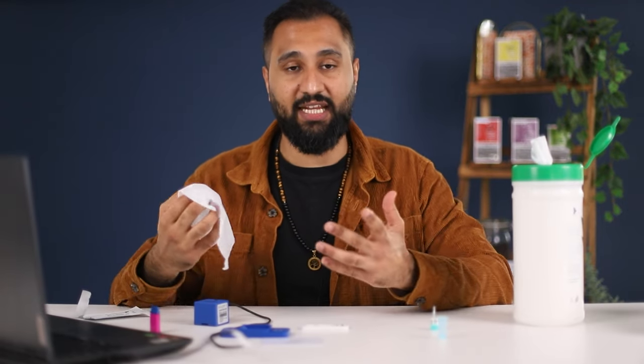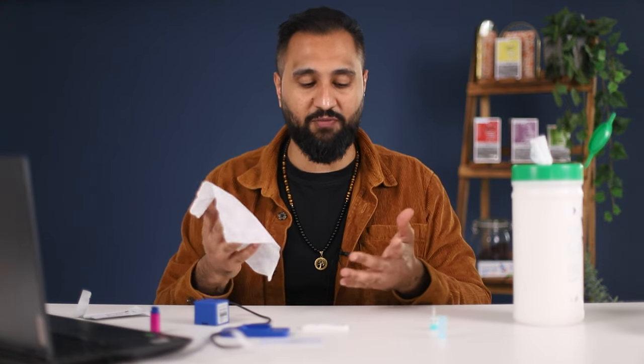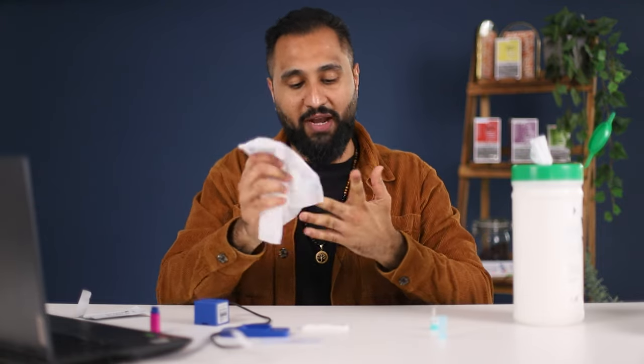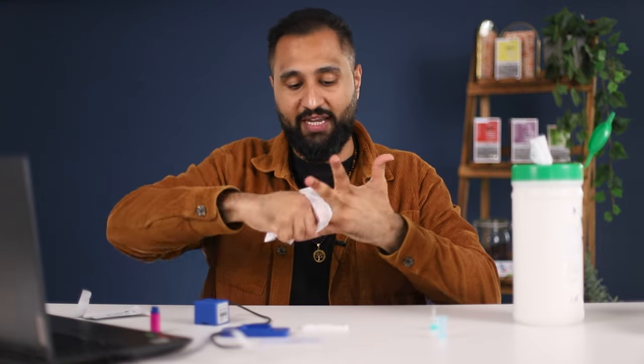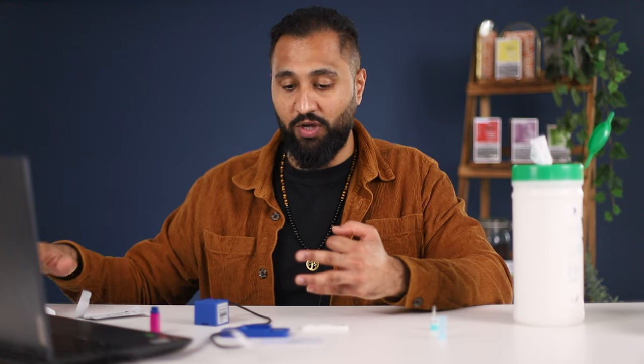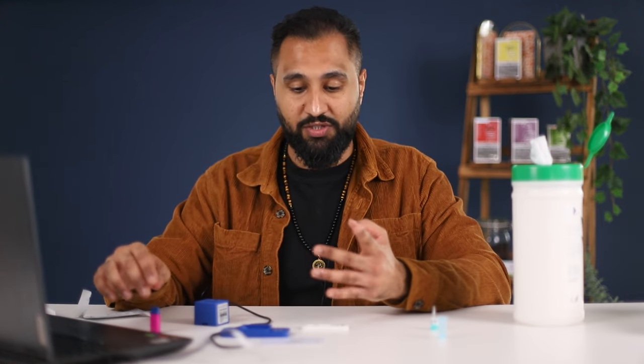The next step is to clean the hand. I'm going to perform the test on myself. Normally if I was performing the test on someone else I would be wearing gloves for my own safety, but because I'm doing it on myself I'm not going to wear gloves for the purpose of this video. I want to wipe the hands down to make sure there are no germs or bacteria. When we perform the test we normally aim for the middle or ring finger, puncturing on the side of the finger, and always make sure you've got tissue ready because we're going to wipe the first droplet of blood.